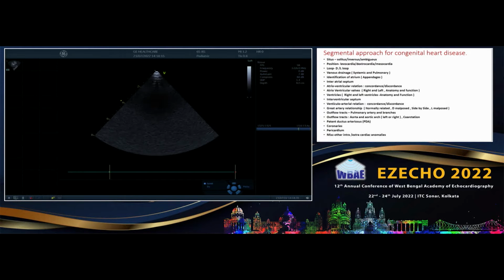Thank you. Next. See, the segmental anatomy itself is a one hour discussion. Trying to make it in 10 minutes is difficult, even a regular echo is also difficult. So how can we demonstrate? It's difficult, but it's just to give an overall idea how it should be done.